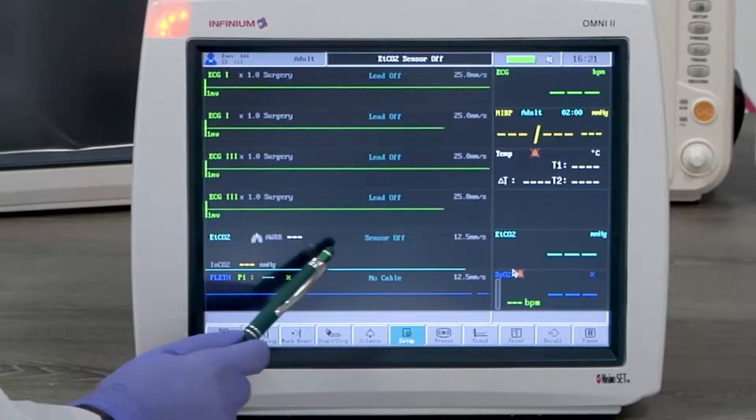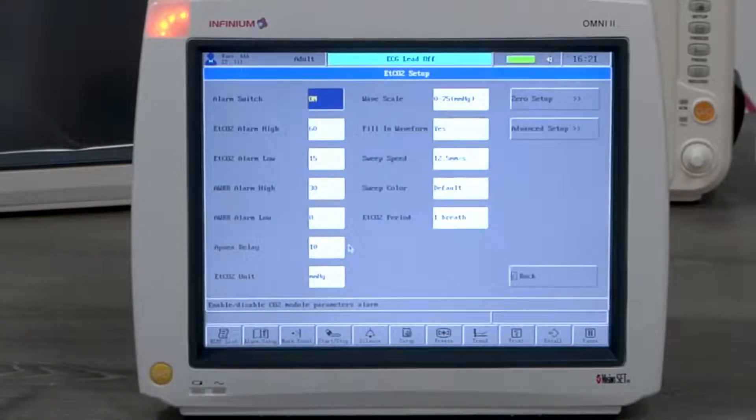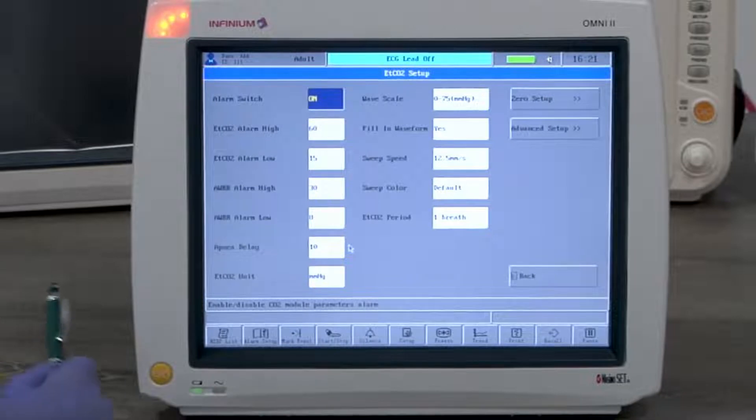Tapping anywhere on the CO2 channel will enter the CO2 setup menu. The setting can be changed according to the user's preference.